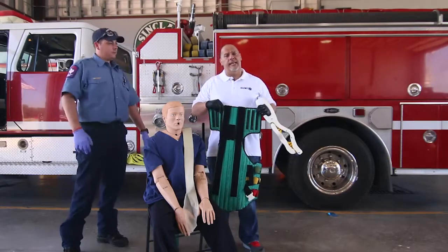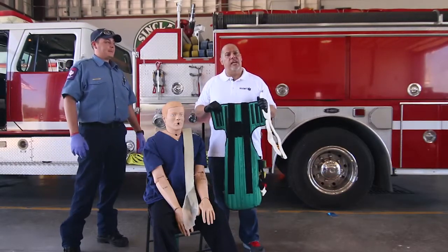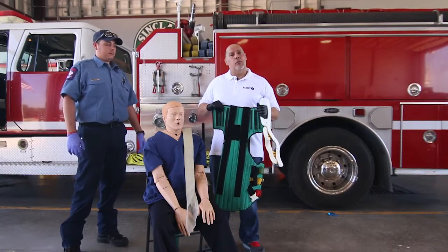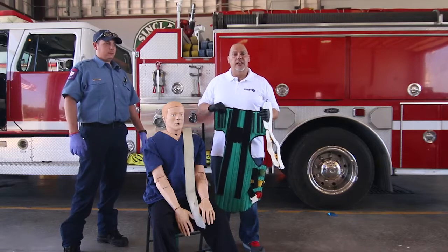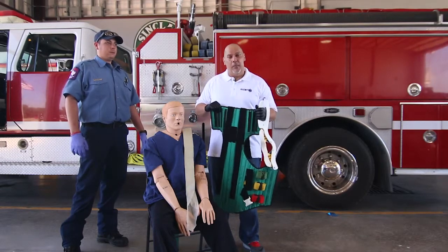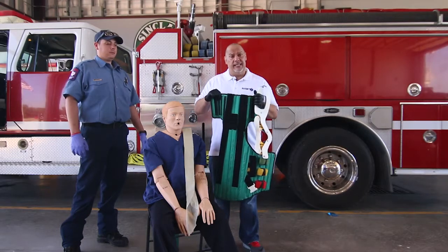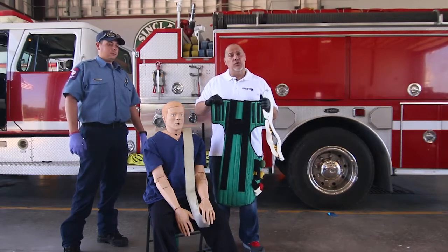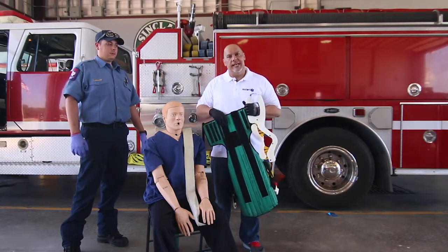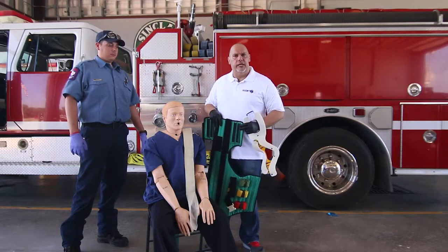What's really interesting about the KED is that it was developed by the Kendrick's racing team for their drivers in NASCAR. One of the challenges they were having was getting those NASCAR drivers out of the car as they were ripping it apart. So Kendrick's came up with this device to extricate his drivers out of their cars, and we've been using it in EMS for a lot of years.